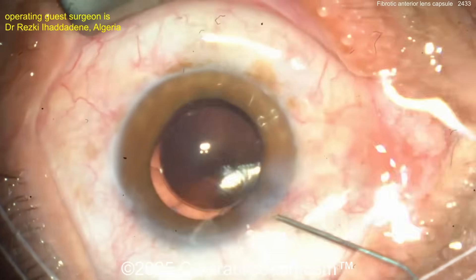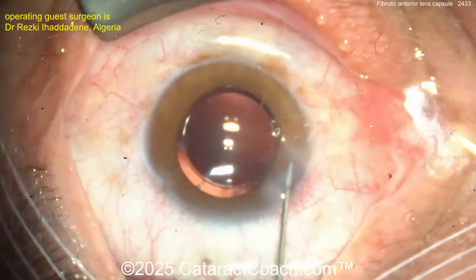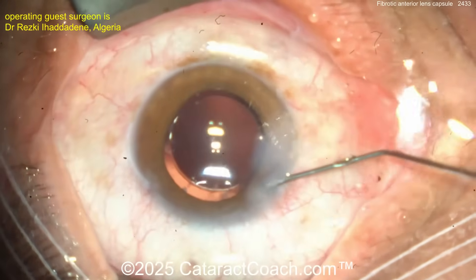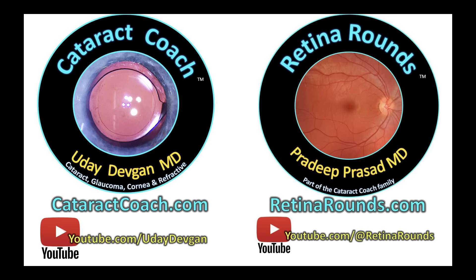At the end of the case — viscoelastic out, seal up the incision. The patient may get a little corneal edema the next day given the phaco energy used, but this patient is going to be absolutely happy. Hydrate the incision — I like to do the roof, not the sides. Fantastic case! Check out cataractcoach.com for instructions on uploading your video.